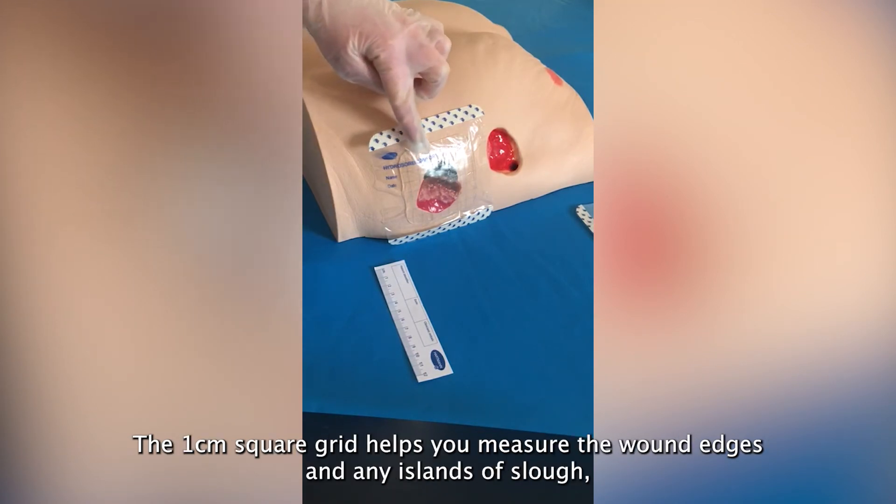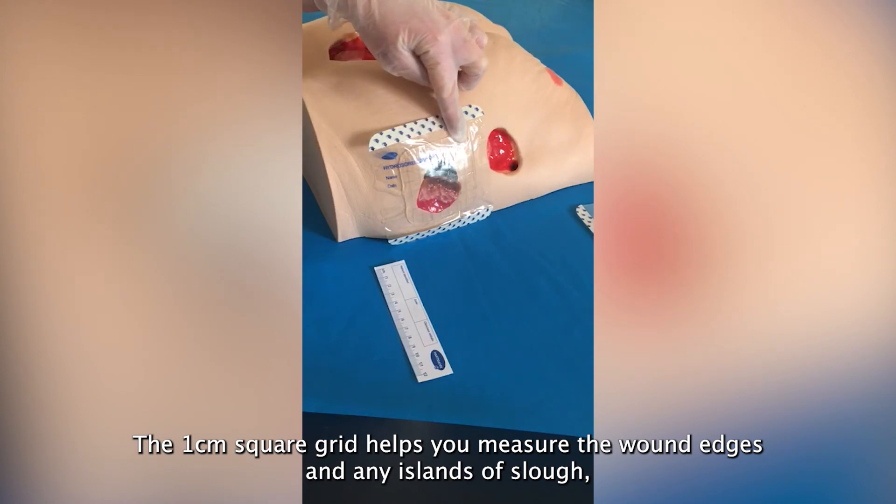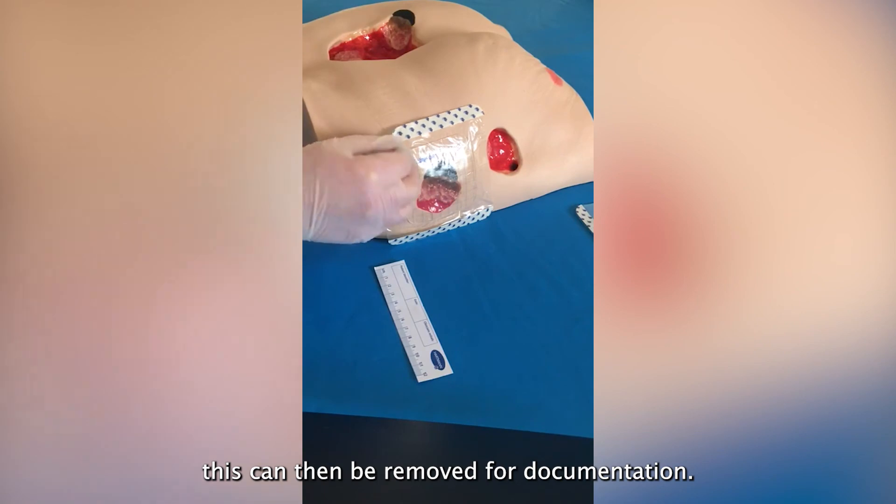The 1cm² grid helps you measure the wound edges and any islands of slough. This can then be removed for documentation.